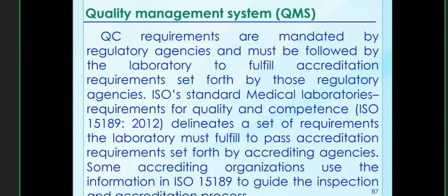Next, about the quality management system. QC requirements are mandated by regulatory agencies and must be followed by the laboratory to fulfill accreditation requirements set forth by those regulatory agencies.